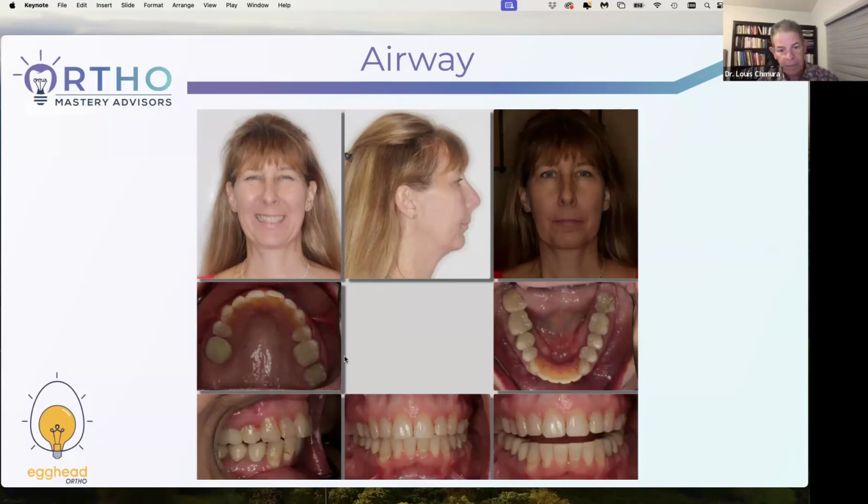And they're lined up without taking any teeth out. There's plenty of keratinized tissue. And now she's got a little bit more width on the top. So her sleep apnea has gotten better, and we can make an oral appliance for her to bring that mandible forward. That's a viable option now. That will work.